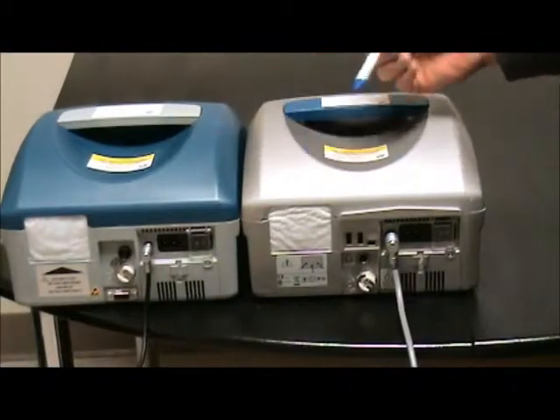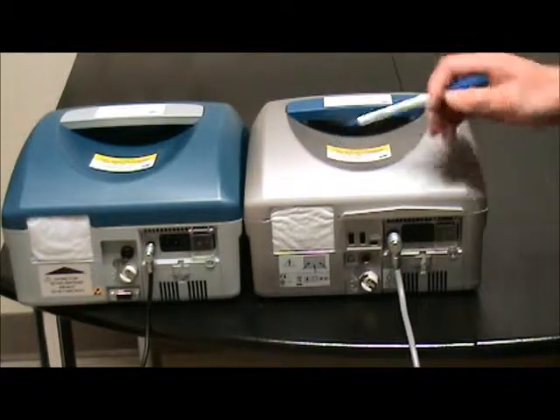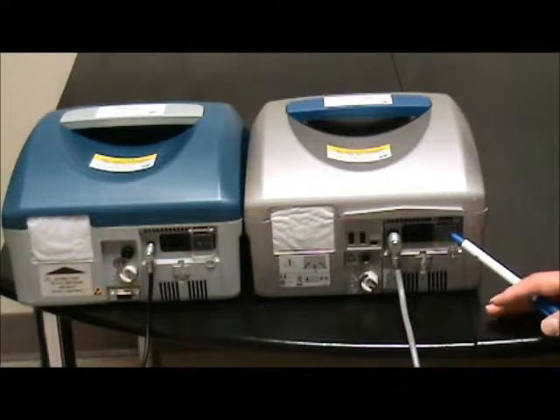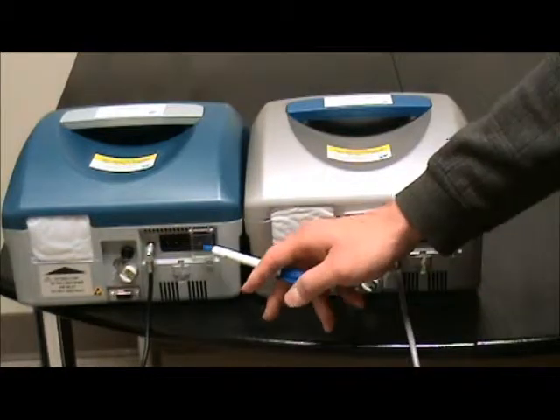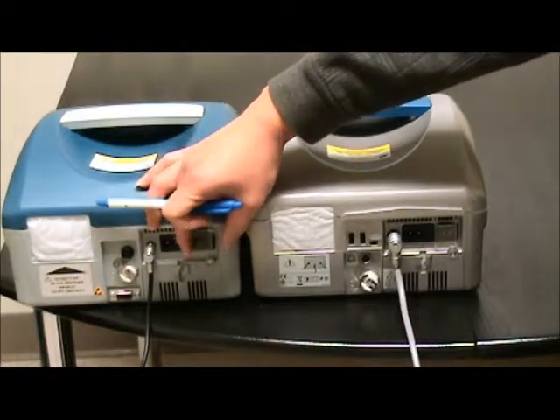At the back of the Legendary and PB560, they're slightly different. You will find a power button that we mentioned before — you need to check if it's accidentally turned off, because sometimes some machines don't have the plastic cover and the switch can easily be turned off accidentally.